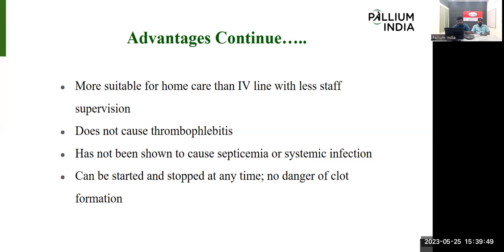Only an experienced staff can do it, or otherwise supervision may be needed in IV cases. But in subcutaneous, no supervision is needed for the sub-Q insertion.